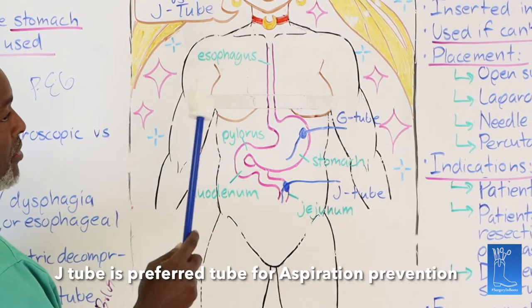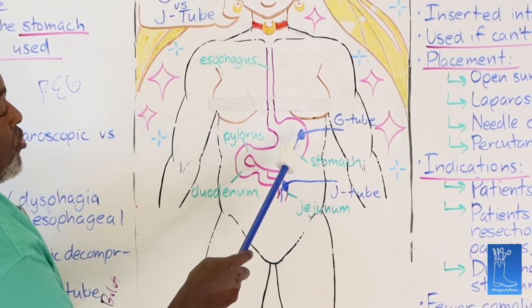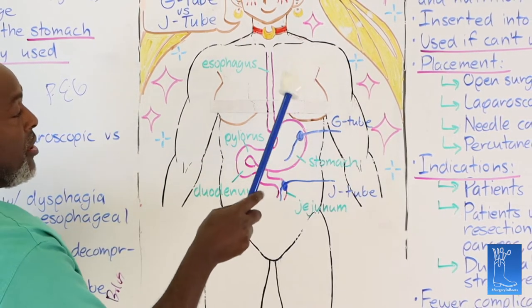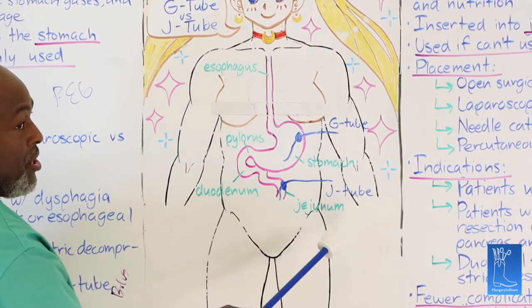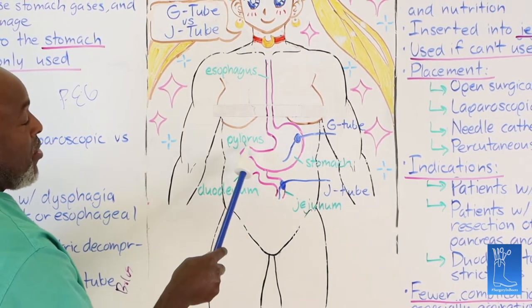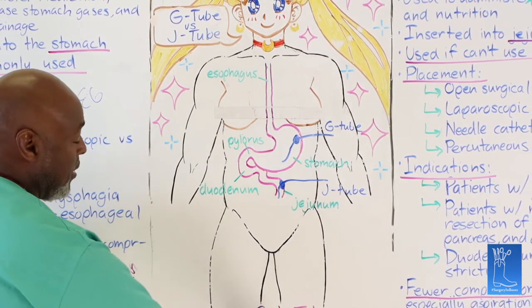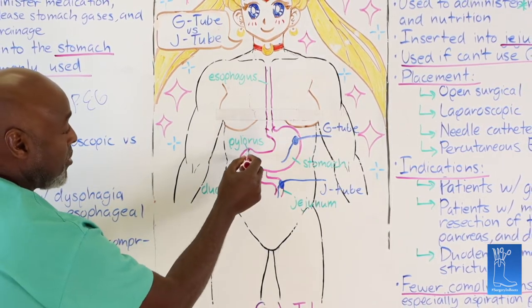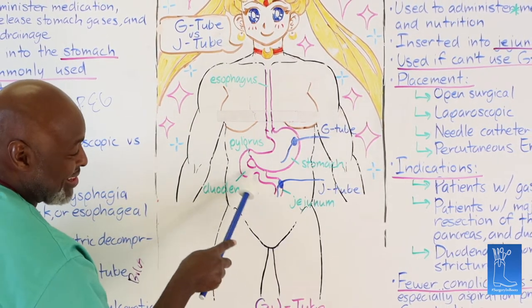The nice part about patients requiring multiple operations in the hospital: if you have a G-tube, because stuff can come back up in the esophagus, you have to stop these tube feedings like food before you do surgery. If you have a J-tube in, you never have to stop tube feeds. Tube feeds can run the entire time because you have not only the pylorus preventing aspiration, you also have the GE junction, that little valve that separates the stomach and the esophagus right there, preventing food coming through as well. So you have two valves to stop food, and these are not close.